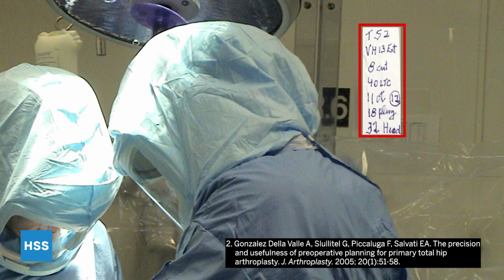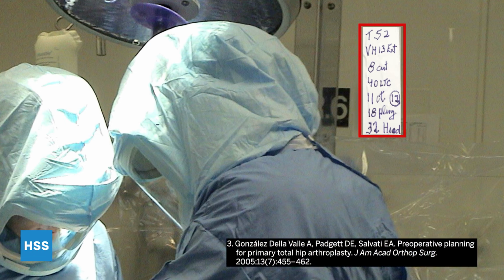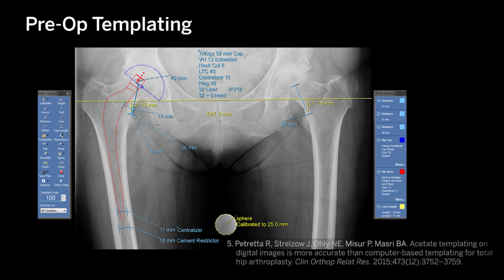We published this technique in detail in the Journal of Arthroplasty and in the Journal of the American Academy of Orthopedic Surgeons in 2005. In 2008, we did a prospective study comparing acetate and digital templating and found that acetate templating was more accurate in our hands. Similar findings were published by Petretta et al. in 2015. Over the years, there has been a shift towards digital templating, but I still find acetate templating more accurate.